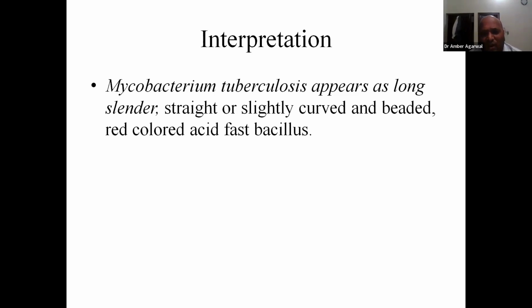Luckily, the patient could afford a GeneXpert and has requested a molecular test. And the molecular test came out to be negative. Thankfully, the lab is subsidized or has funds, so they repeated the test and still it was negative. Can anyone think of a diagnosis, where your staining is positive, but the molecular test is negative? Any diagnosis?